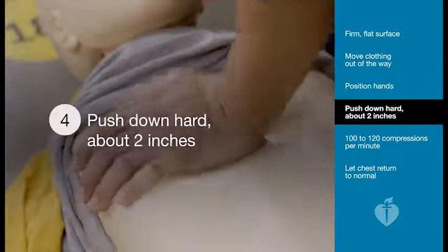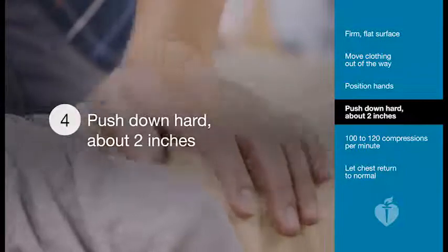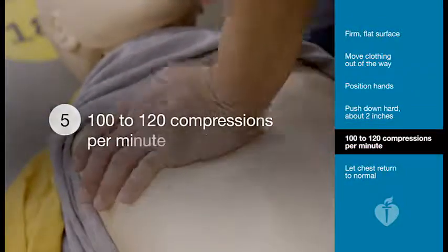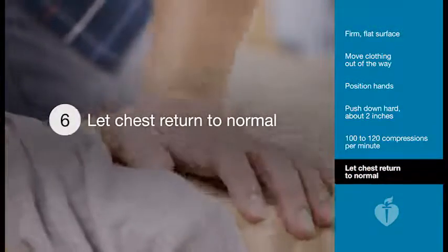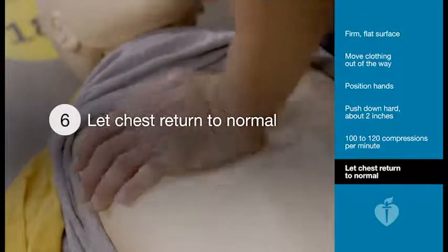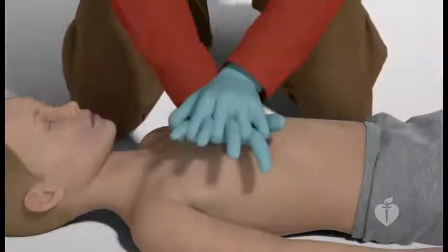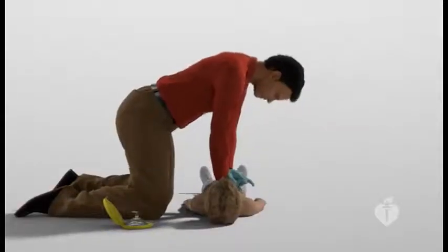Push hard and push fast. Push straight down on the center of the chest about 2 inches. Push at a rate of 100 to 120 compressions per minute. After each compression, let the chest come back to its normal position. Keep compressions going until help arrives or the child responds. Push hard and fast in the center of the chest.